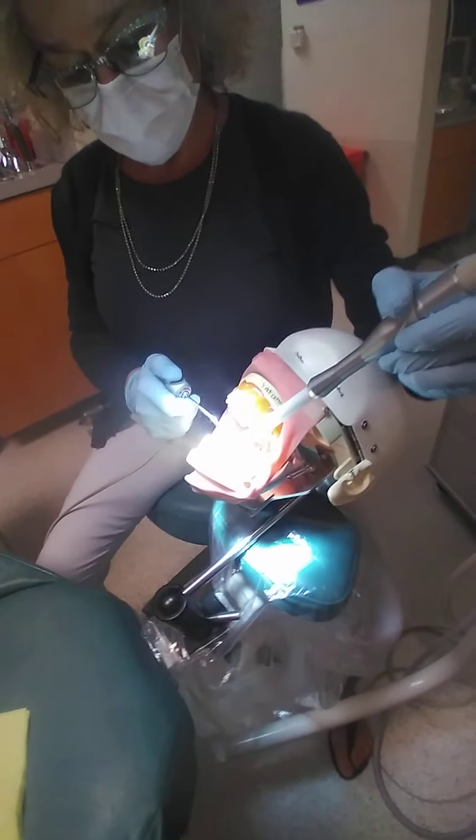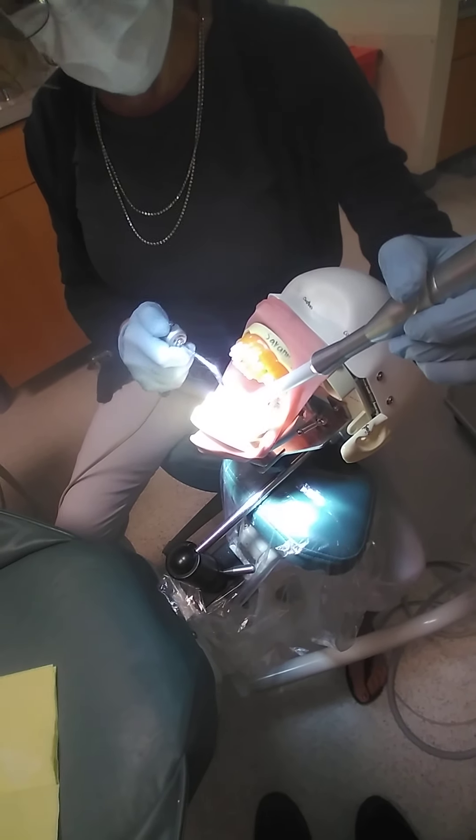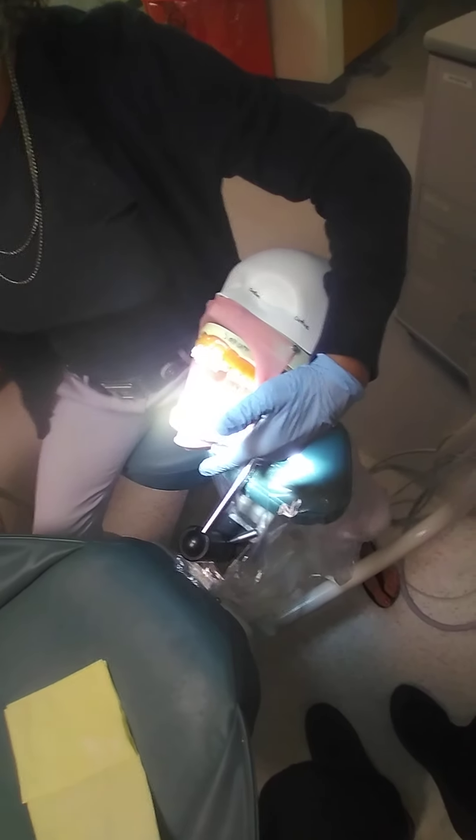I'm going to do a limited rinse — just get the tooth wet, not the cotton rolls. I'm just cleaning the tooth; I'm not removing the smear layer. The only thing that removes the smear layer is going to be our phosphoric acid etch.